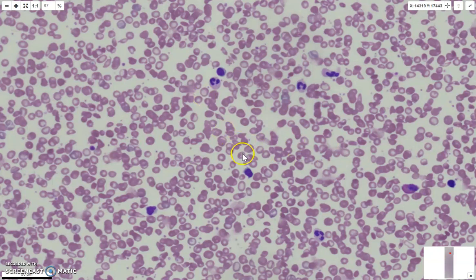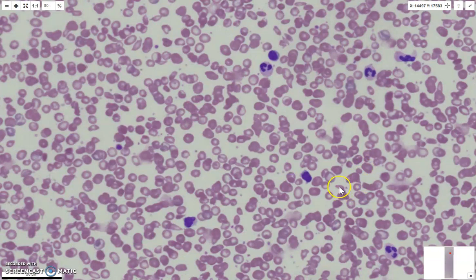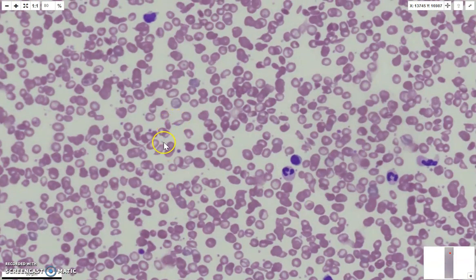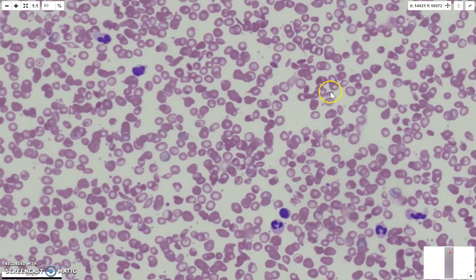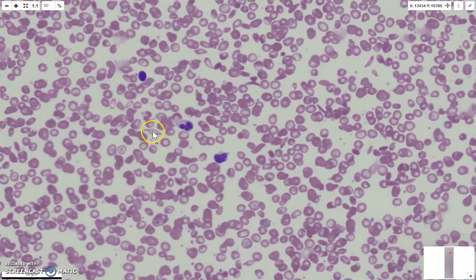And in this particular case, it is the HbS or hemoglobin sickle. So HbS will produce these sickle cells, and these guys here that I'm clicking on are sickle cells. So sickle cells are produced by the polymerization of hemoglobin to the edges of the red cell. So it's an abnormal hemoglobin variant. Here we are, there's sickling there and there. And there, can you see these pointy edges of the cells? And here, pointy, pointy.